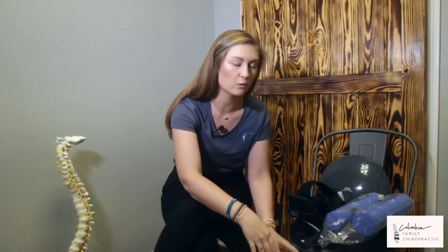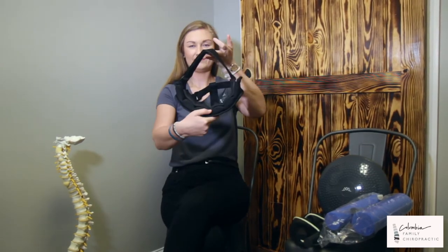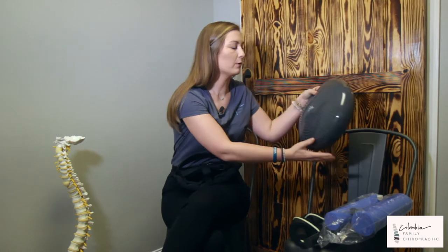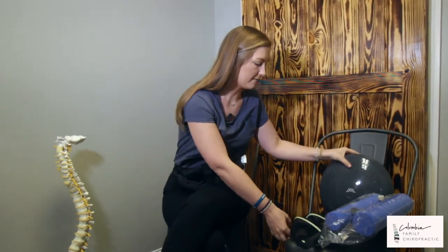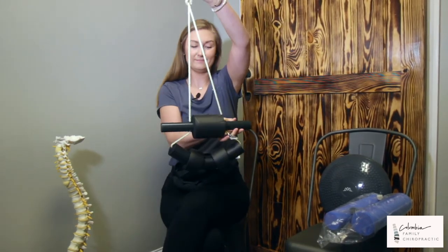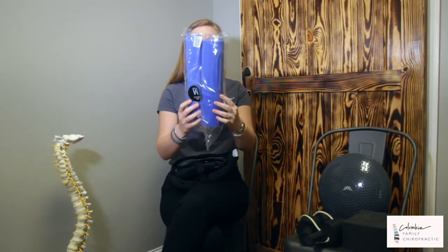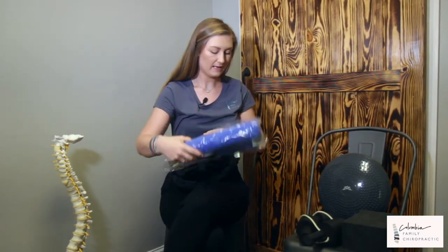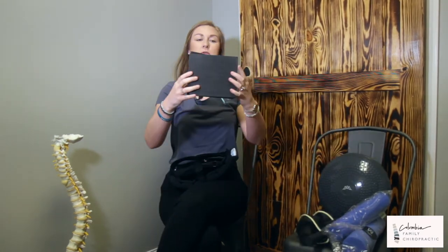Before I do go into detail, I do want to just show you each piece of equipment so you're aware of the name. First, we have our head weight. We also have our wobble cushion. We have our cervical traction unit, which can be used multiple ways. We have our rolls, a large and small roll. And the last possibility would be our blocks.